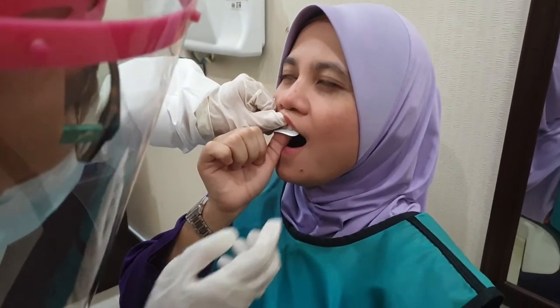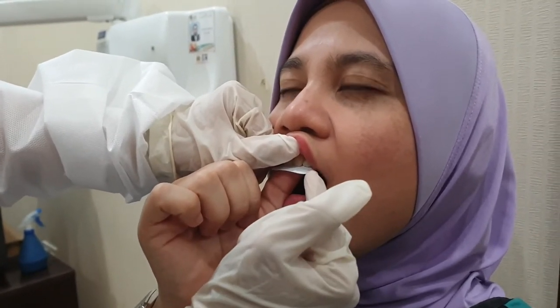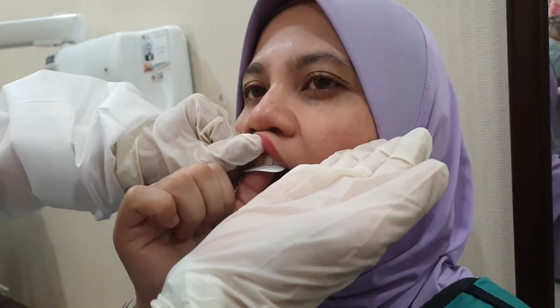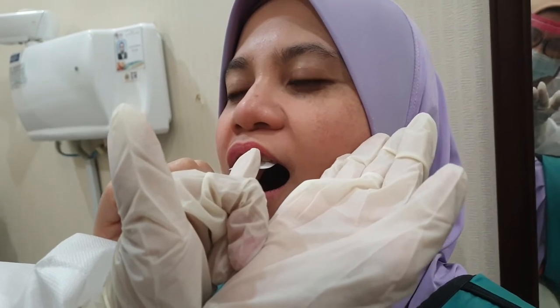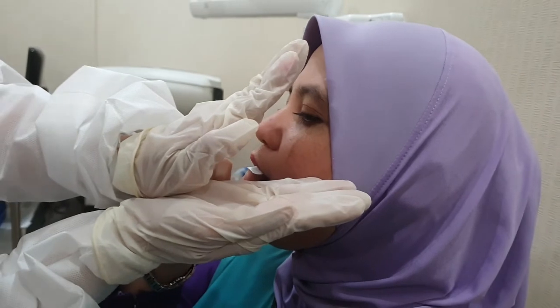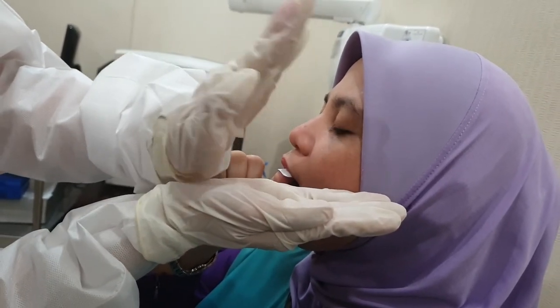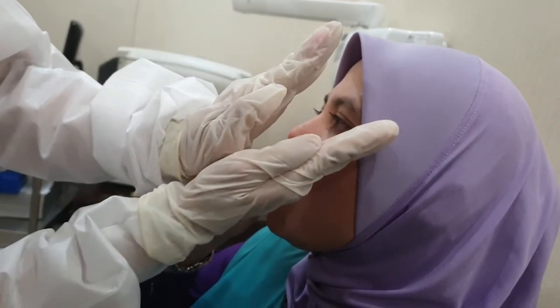Now, please observe carefully the angle of the film. Approximately, you can imagine the angle line of the X-ray film like this. Now I want you to imagine the line of the axis of the tooth — for example, tooth 21. So I would imagine this is the imaginary line for the film, and this is the long axis of the tooth. Now imagine there is a bisecting line between the line of the film and the line of the axis of the tooth — I would imagine it at about 45 degrees around here, bisecting between these two lines.